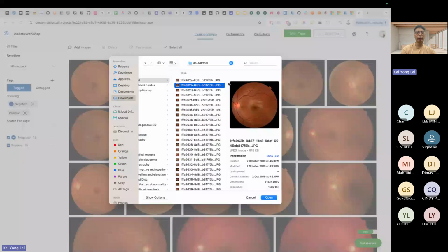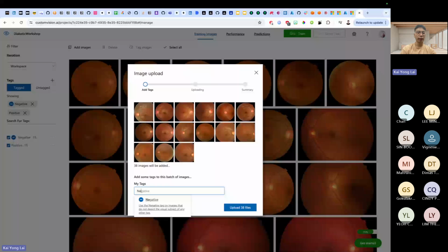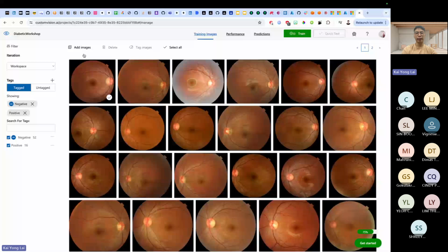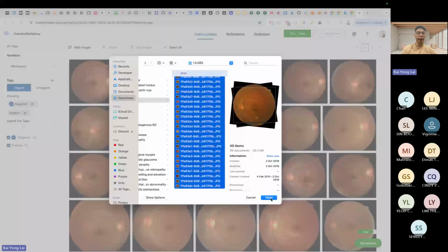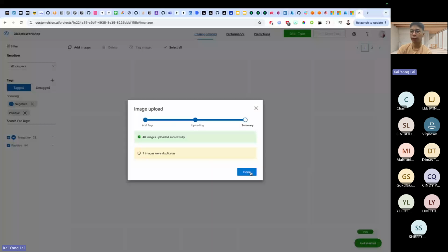But we can add more data to make our models more accurate. So what we'll do is we'll go to the 1000 images and click on the normal one. Let's just submit all of the normal ones as negative. Okay, upload everything. This might take a while because it's double the number that we had just now. Okay, and then we can add the DR2. You can take everything that is false in the DR2 and classify it as positive as well. Okay, so now you should have 52 negative images and 65 positive images, supposedly. Let me see. Oh, 64, because there are duplicates.